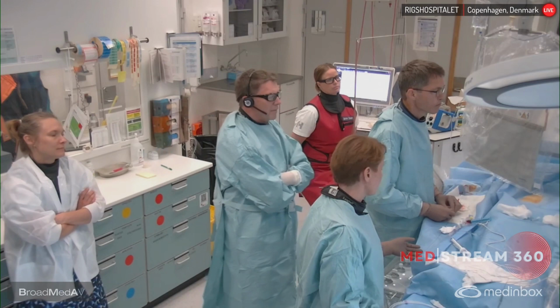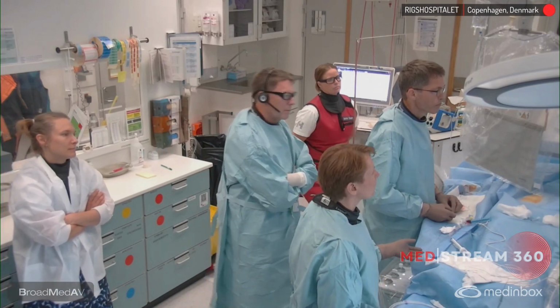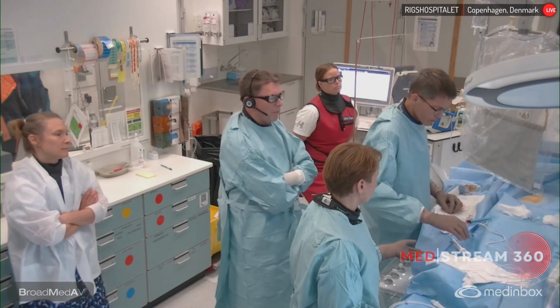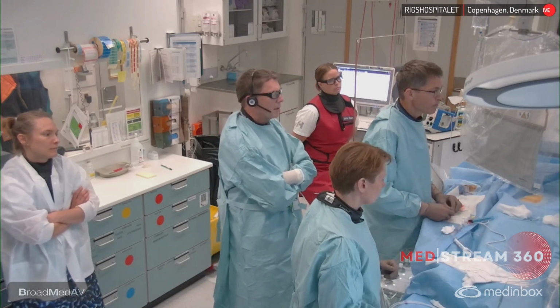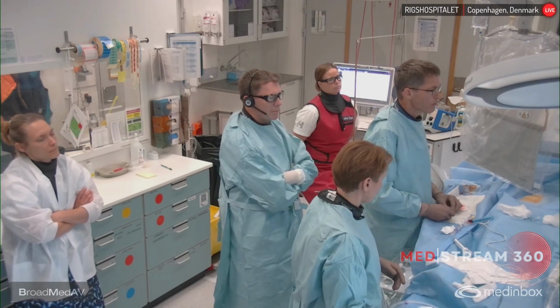The patient on the table is a 54-year-old male who has hypertension. He was hospitalized with stable angina a couple of weeks ago. He has actually been running a marathon 3 months ago. He had a coronary CT scan prior to the angio, which showed a distal left main stenosis. He had a left ventricular ejection fraction of 60%.